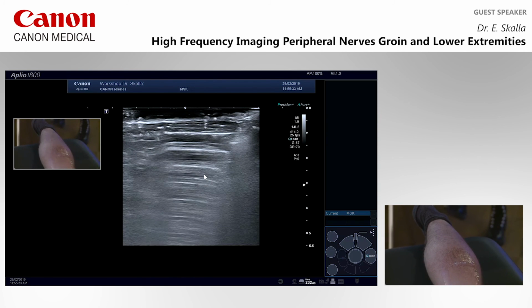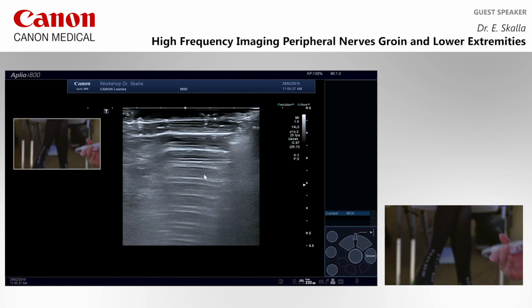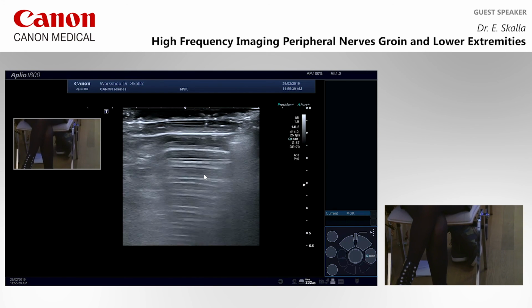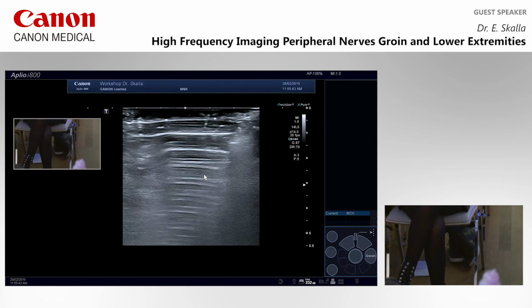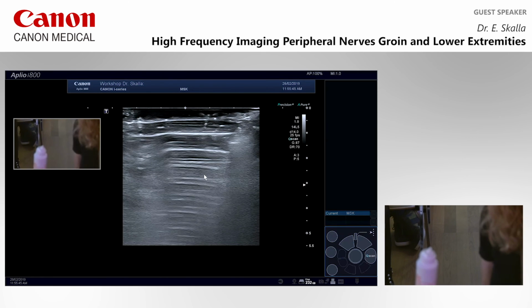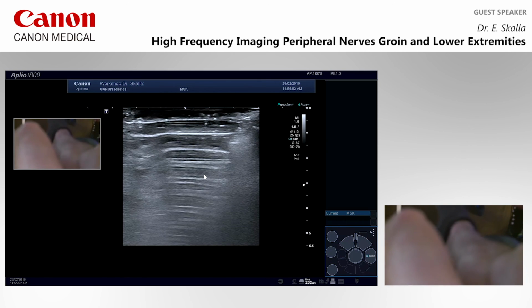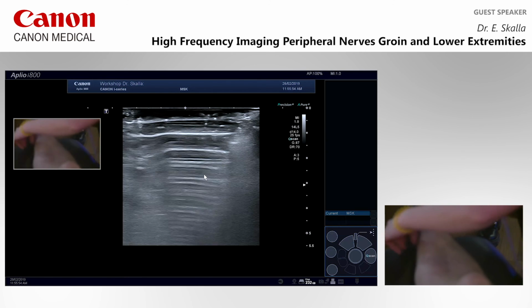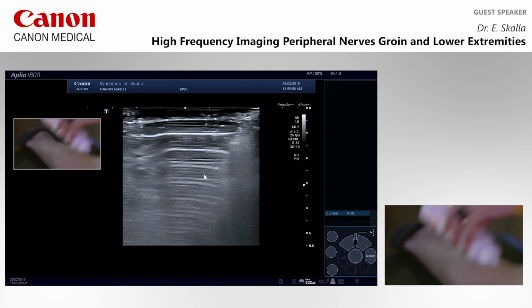Jetzt müssten wir wieder umdrehen, bitte. Gerade so ein bisschen nach außen drehen. So. A slight external rotation.